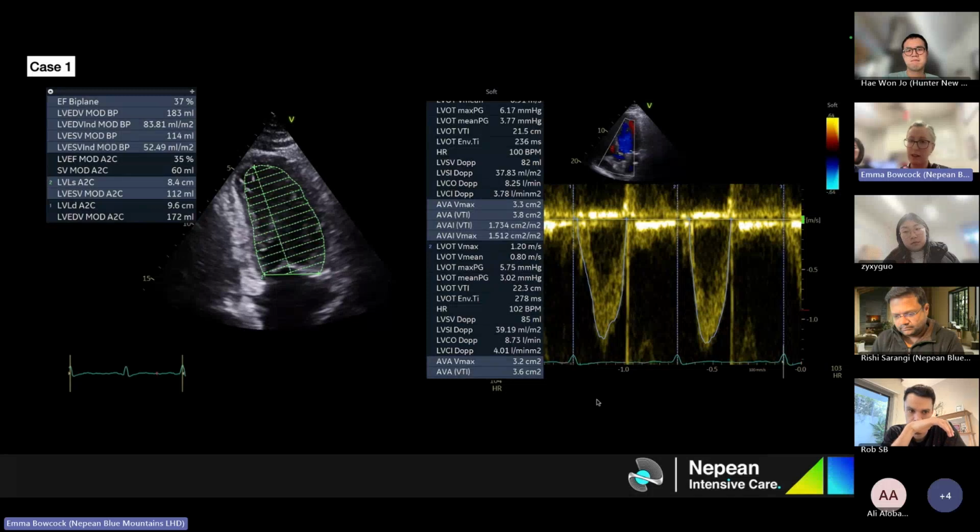I think her VTI is preserved at this stage. She hasn't got severe heart failure, but I think it's preserved because she's gone through her pregnancy and increased her blood volume. Her stroke volume and blood volume have increased 40% or so in pregnancy. So she's already remodeled and got a higher blood volume. So even though her EF is down, she's got more total volume, which is why her VTI is preserved.